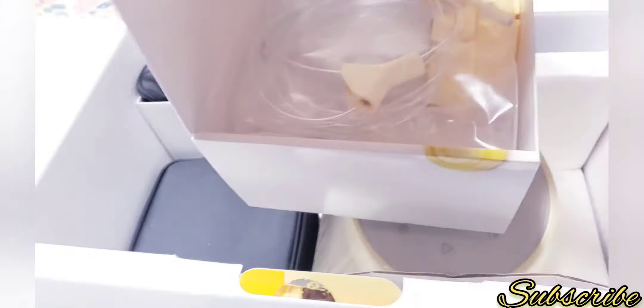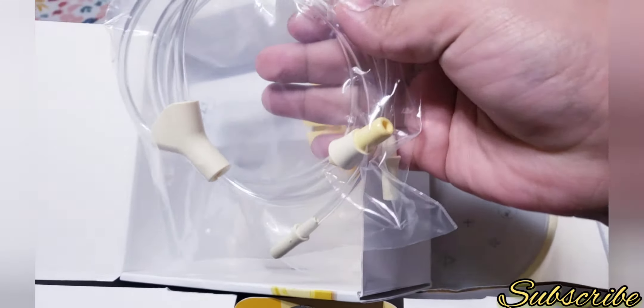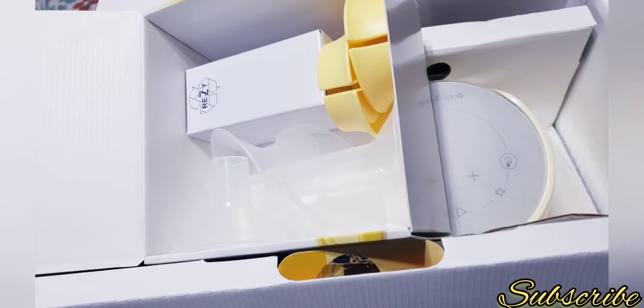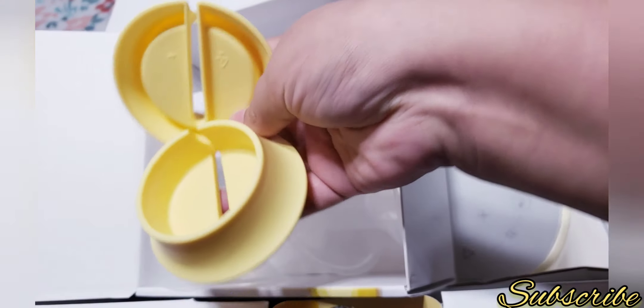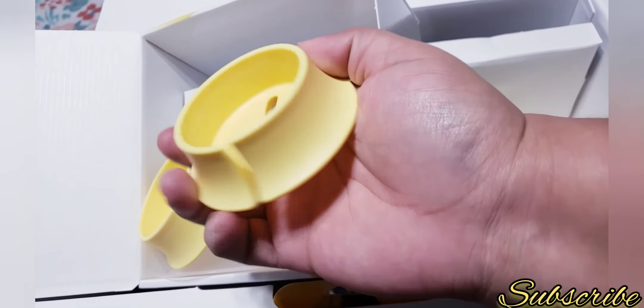When you open it you have these little tubes that connect to the breast pump. It also comes with a bottle stand so the bottles won't fall — you put it on your table and the bottle will not fall down. That's great, though I never used this part.